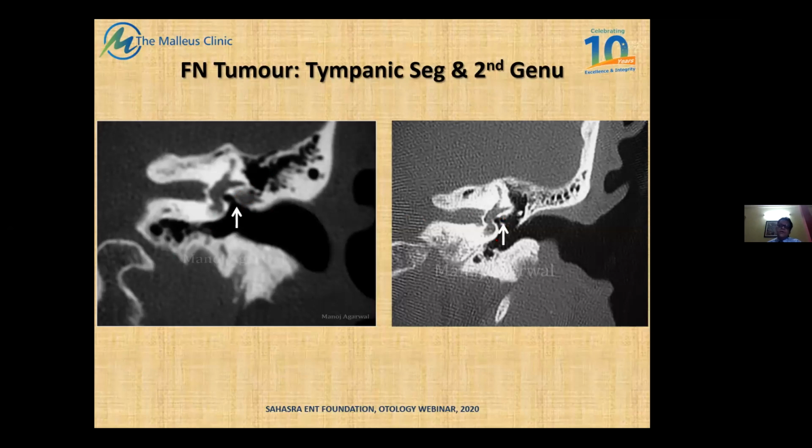You can see the head, and I beg your pardon, the arrow came in over the head of the stapes, but this is the tympanic segment of the facial nerve here. And see how widened the tympanic segment of the facial nerve is over here.